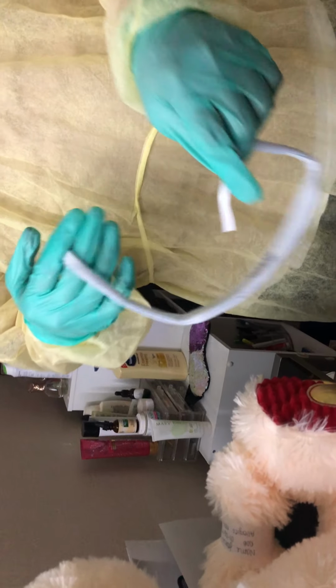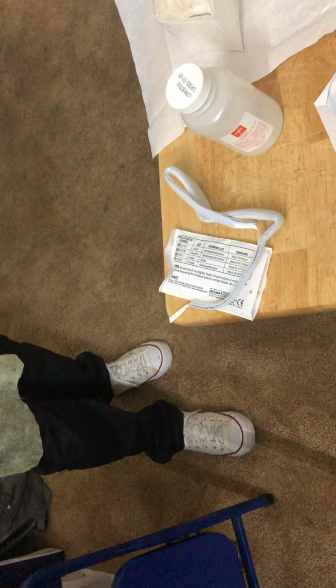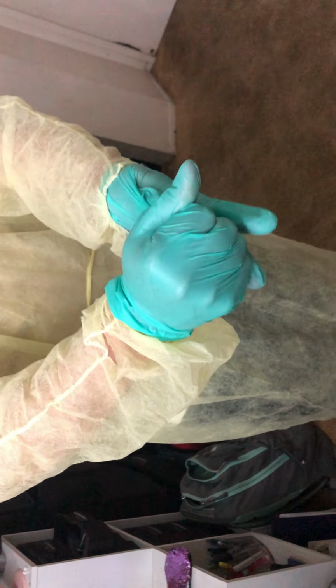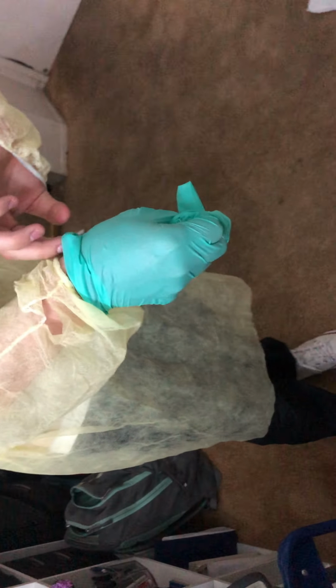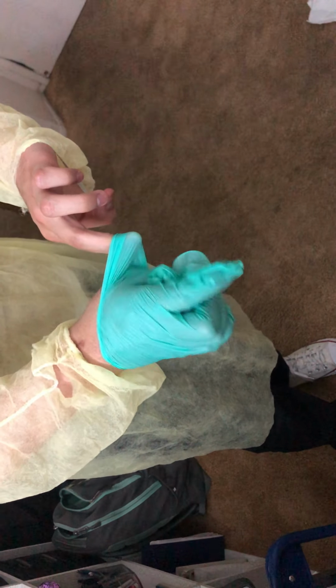As you can see, it's touching my gown and everything. And I would get a new one. Just ask my CNA to get me a new one. Take off my sterile gloves in the meantime. Two fingers underneath. Dispose of that. Hand hygiene. Put on regular gloves. I'm going to pretend to put on regular gloves because I don't have any regular gloves out now. But put on regular gloves and open up a new packet.